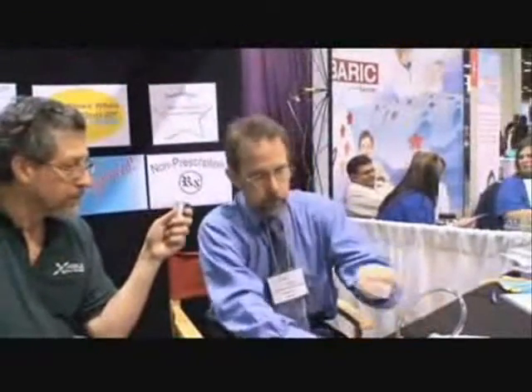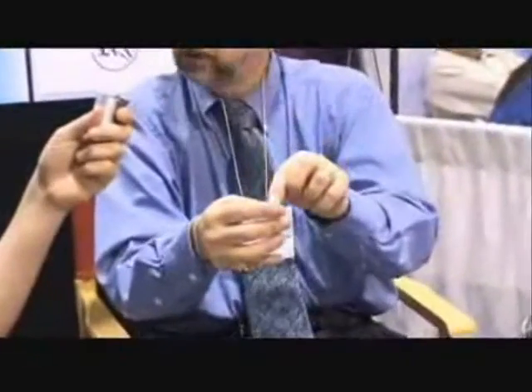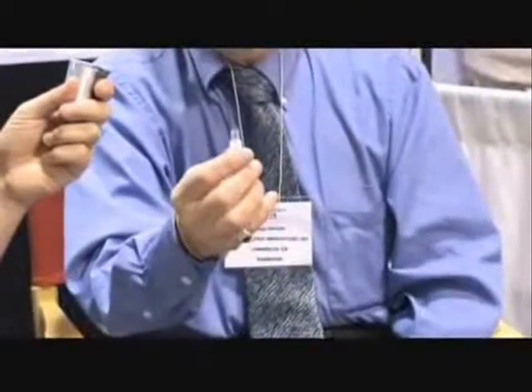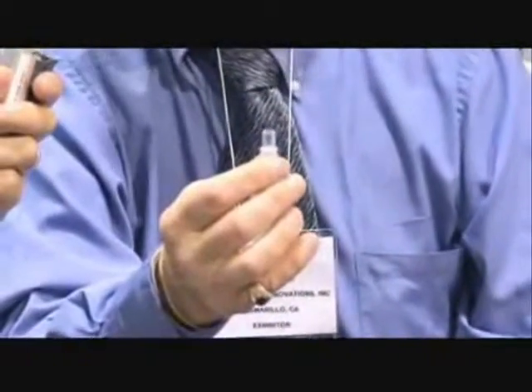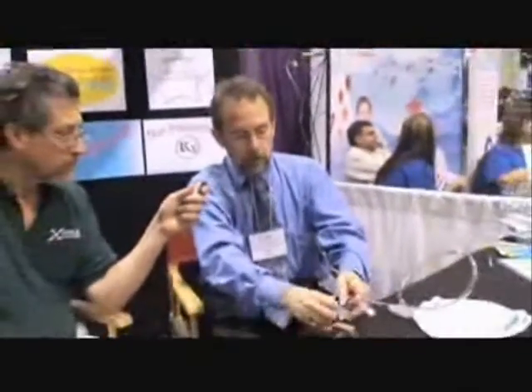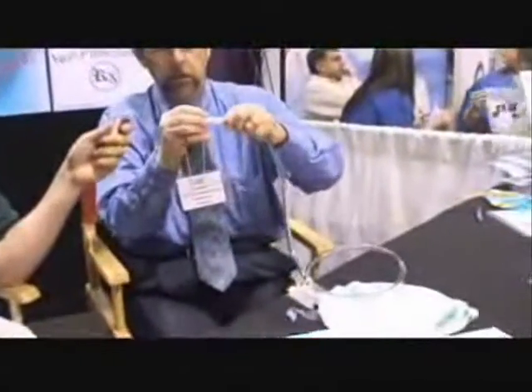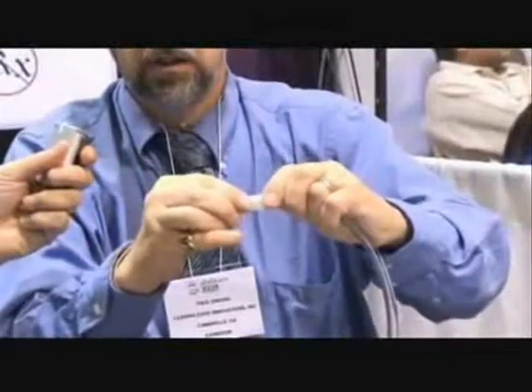The second issue that came into play was that the nozzles that were on the catheters are just a clear tubing. And the only way to put a connector onto those tubes was you slipped it on. Those connectors constantly come apart. So what had to be done was I decided to develop a connector that would stay with the catheter. Each catheter comes with its own connector. And now you have a quick connect disconnect where you actually can put it apart and take it on and off.